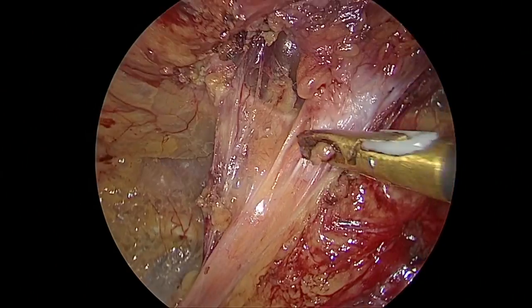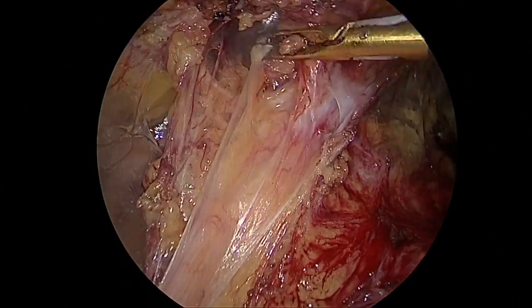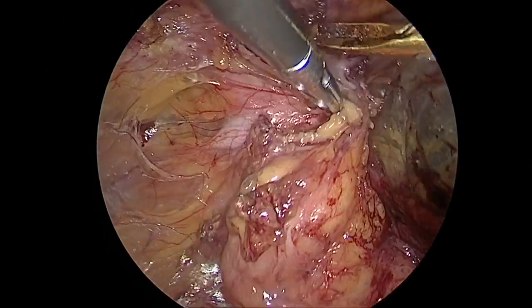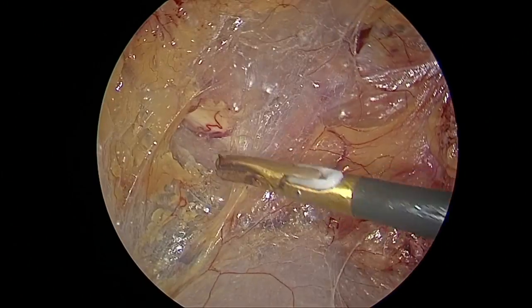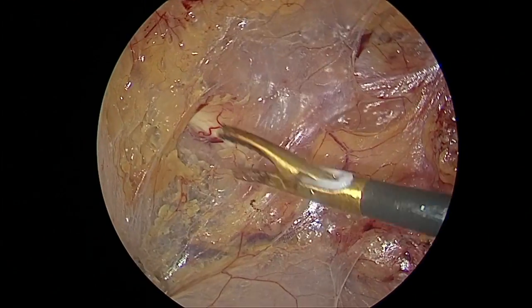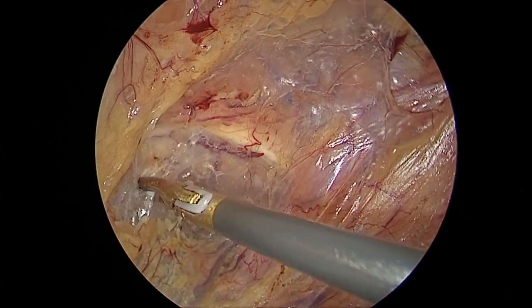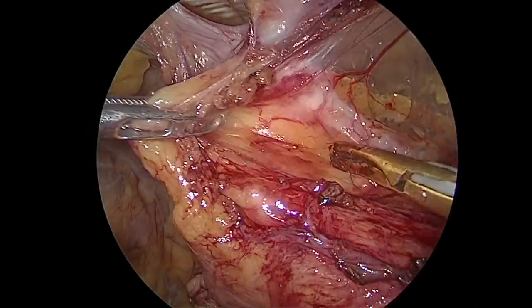So once the sac has been partially dissected, I have found that there was tough tissue on the right side of the screen or on the right side of the hernia. So here I am dissecting inferiorly to make sure that if we are putting in the mesh, it should cover the inguinal spaces also and inferior to the hernia.